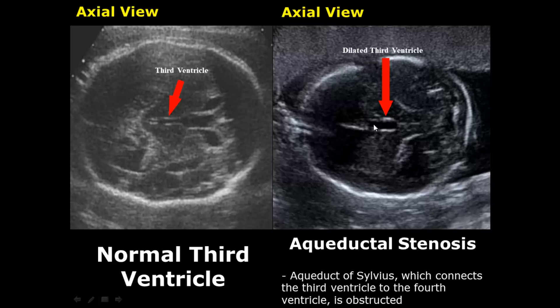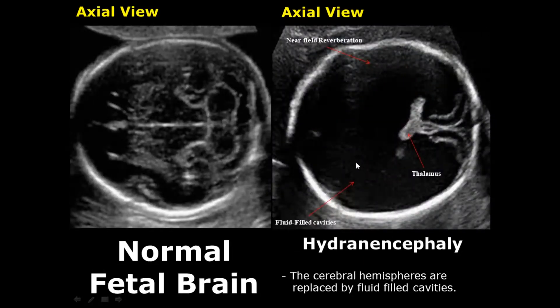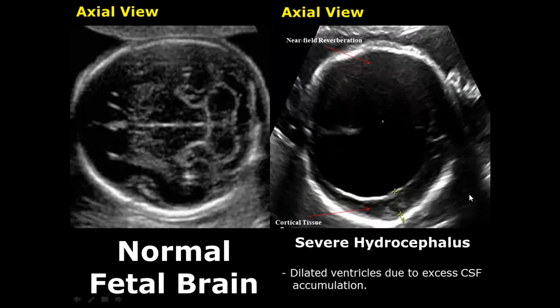The normal third ventricle has a slit-like appearance, whereas when dilated it will have a rectangular appearance. Hydranencephaly is a rare condition in which the cerebral hemispheres are replaced by large fluid-filled cavities — no brain tissue is seen here, with only minimal visualization of the thalami. One way to distinguish hydranencephaly from severe hydrocephalus is the presence of some cortical tissue in severe hydrocephalus.